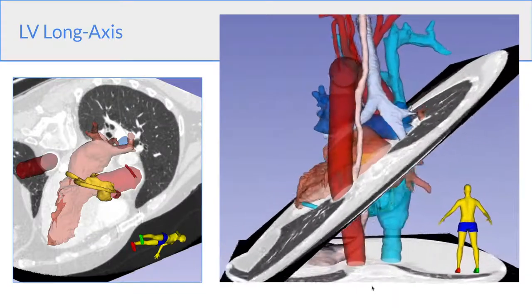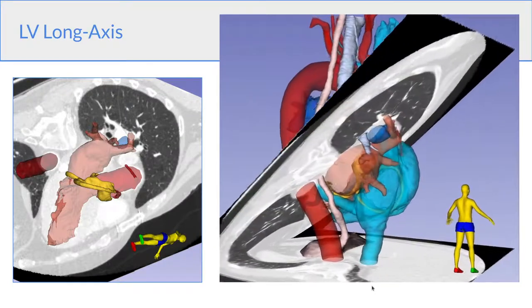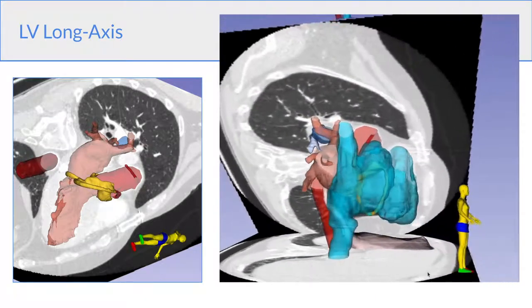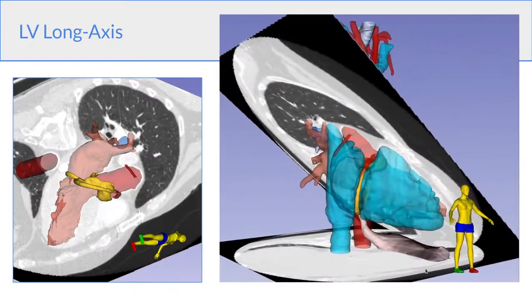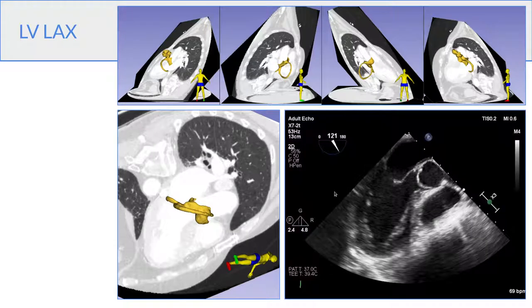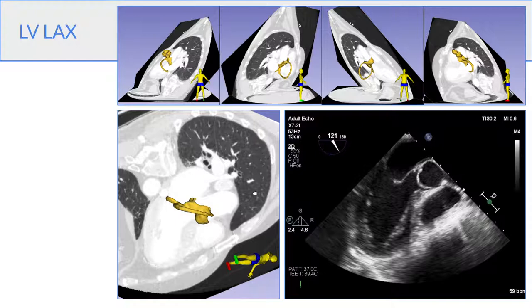And again, note the orientation, that we're looking from below the slice in TEE. So here along the top again, you have the cut plane shown in the four cardinal orientations. So you can see that the tricuspid valve is in front of the screen, the RVOT is here, the pulmonic valve is behind the screen, and the aortic valve is going through the slice.